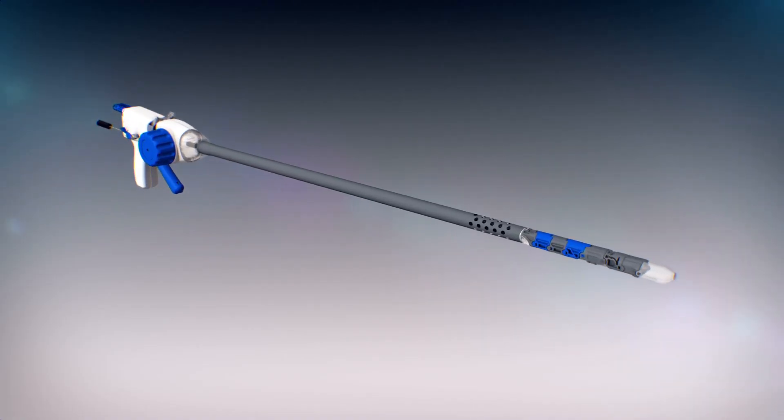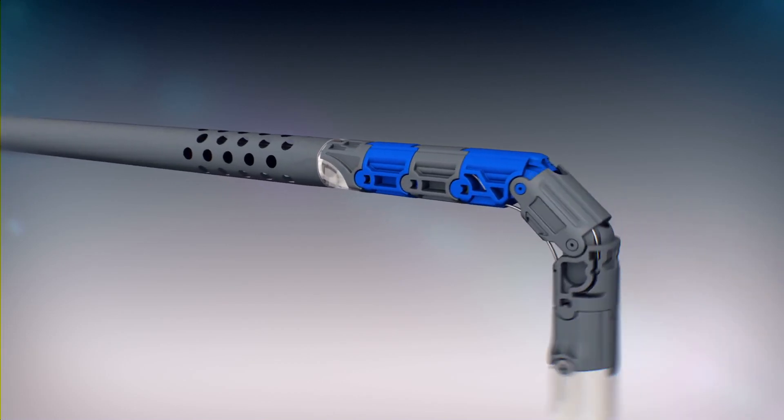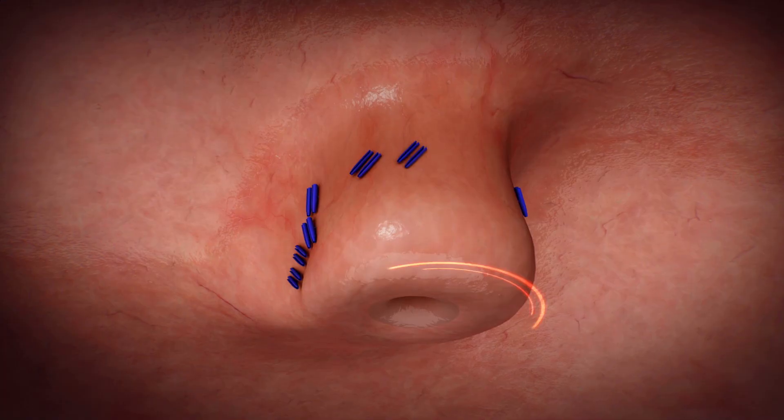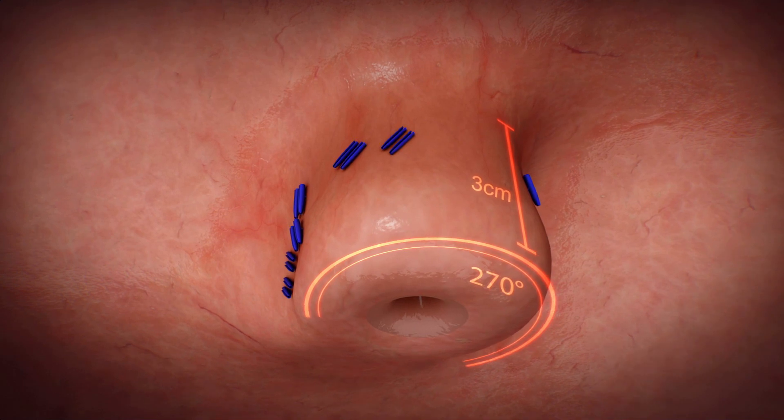The EsophiX technology is designed to rebuild the valve from inside the stomach using a transoral approach, with the goal of creating a partial fundoplication that measures 270 degrees in circumference and 3 centimeters in length.